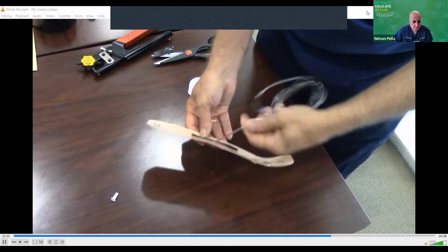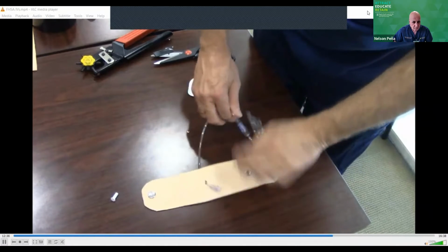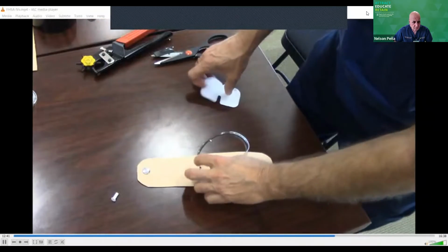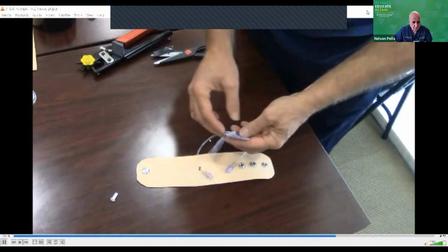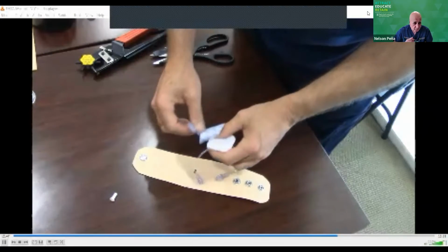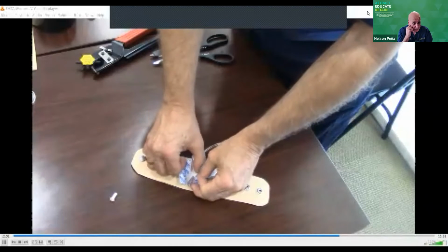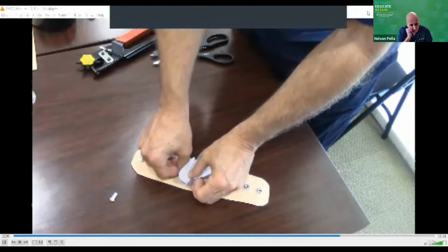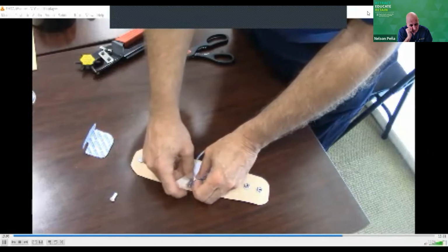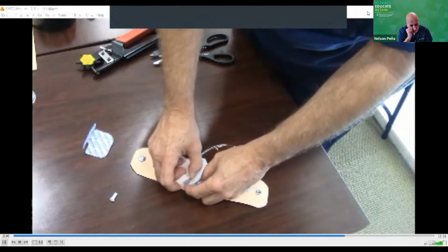Now once you have the back end, the inside part of the IV tubing hooked up, I'm going to disconnect this tubing now, just to make it easier for me to work with. I'll connect it later. Now I want to use some kind of fixation device similar to whatever it is that you use in your facility. And I'm going to put that around the IV to make it look real and professional. And this is one of the ones we use in our system. So I'm going to go ahead and finish that off.